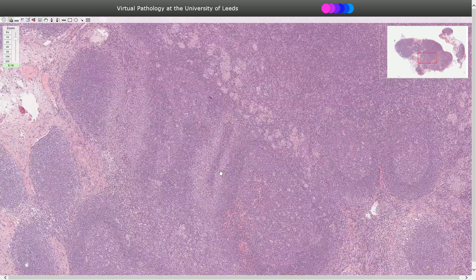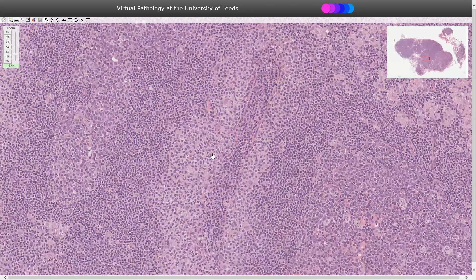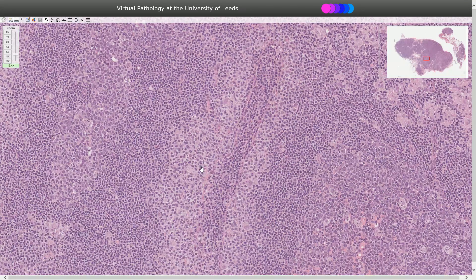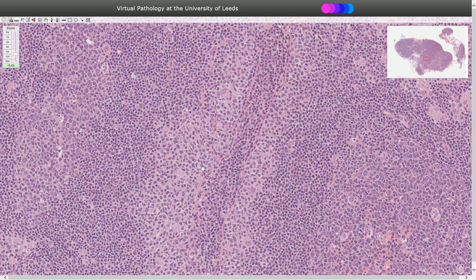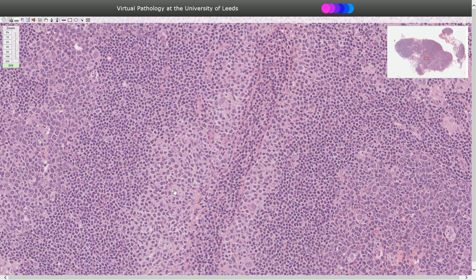The lighter areas are composed of monocytoid B cells, which are positive for CD20. These cells have voluminous cytoplasm and a centrally located round or oval-shaped nucleus, and the borders of the cells are quite visible.